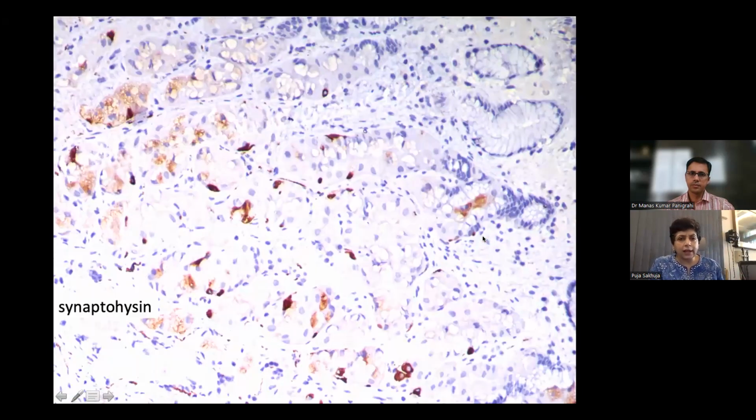Now, this is a synaptophysin stain, which will pick up the endocrine cells. This is a biopsy from the gastric body mucosa. The dark brown stained cells are the endocrine cells, and as I told you, these are slightly triangular in shape, and these are haphazardly arranged throughout the crypts in the gastric body mucosa.